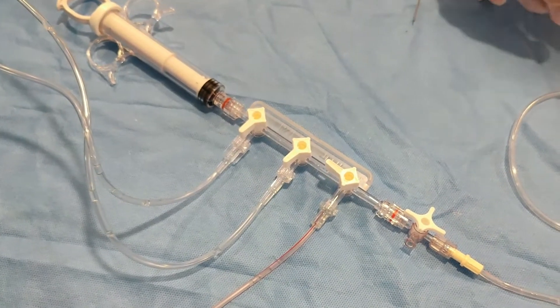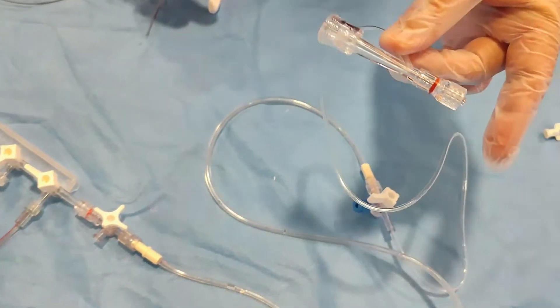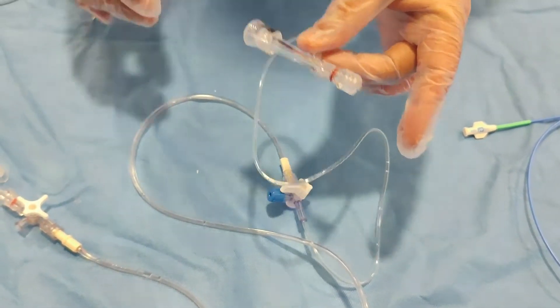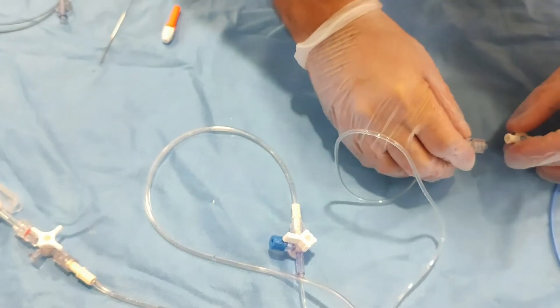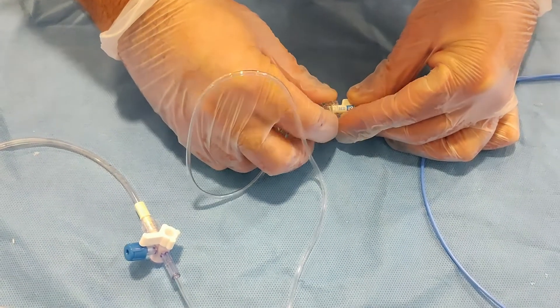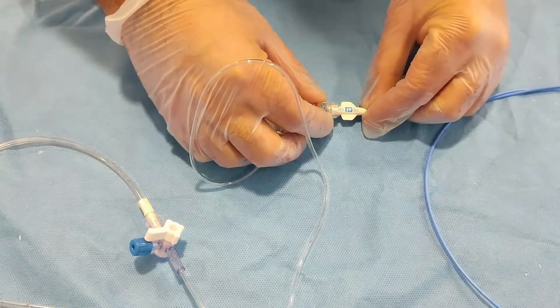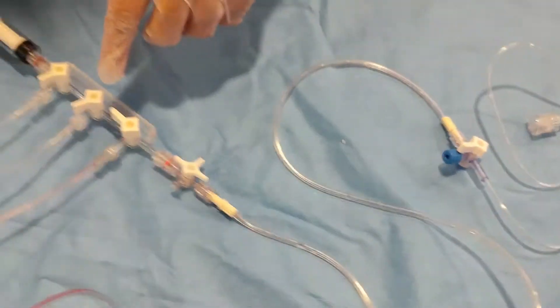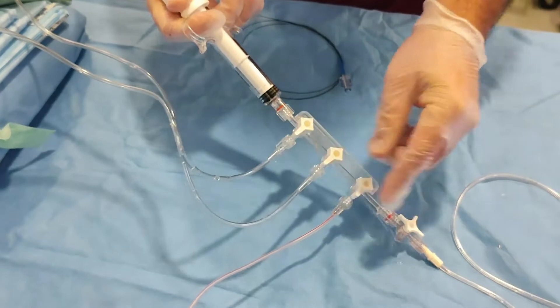So once you close the saline, then make it pressure open. Now this anti-bleed or this y-connector is now ready. So once it's ready, you can make it a fluid-to-fluid phenomena, attach it to the catheter which is already inside the patient.